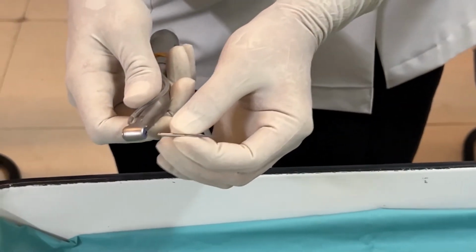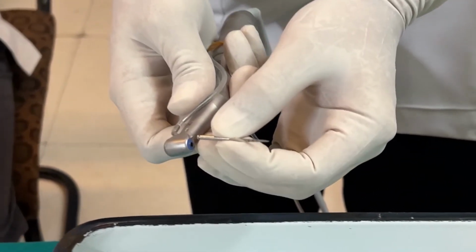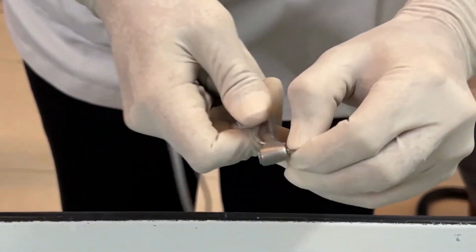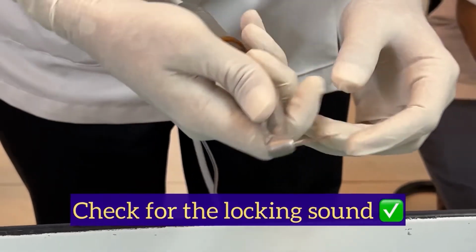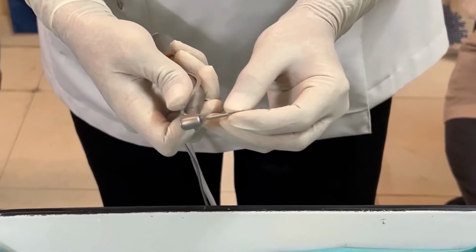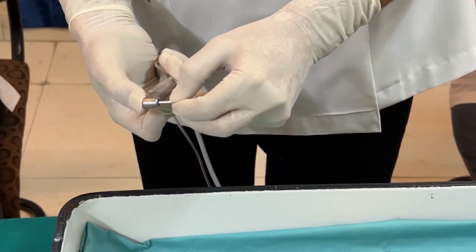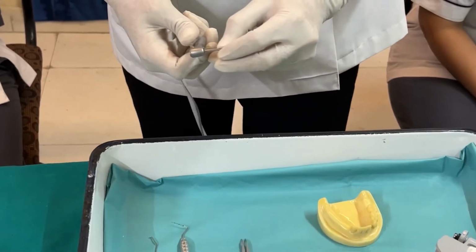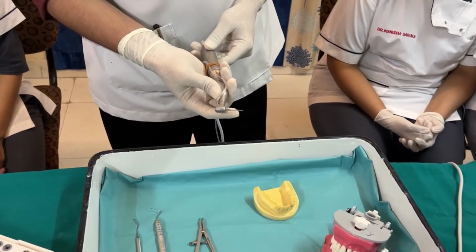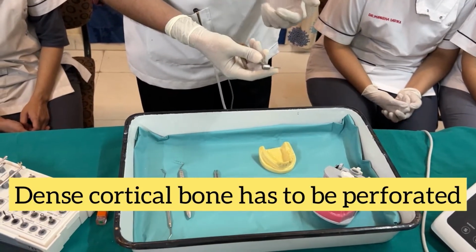So the method of attaching any osteotomy implant drill to a Physiodispenser handpiece basically is that we rotate it till we get a sort of a catch, and while removal we have to pull it like this. So the point remains the same. While putting, no need to press the button, you just have to engage, and while removing you have to press the button. Is it fine? So what exactly is the purpose of this lance drill? The purpose of this lance drill is that the dense cortical bone has to be perforated with it.